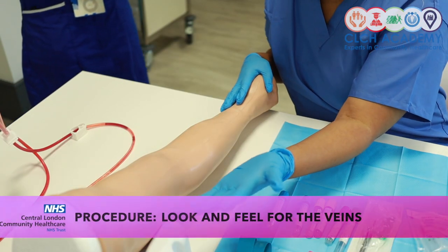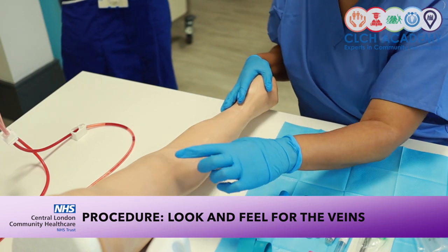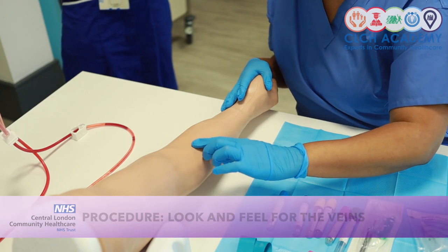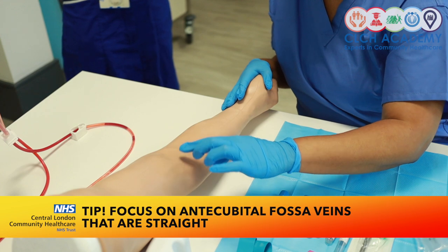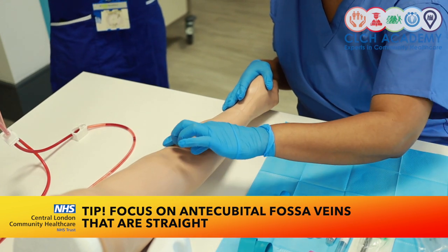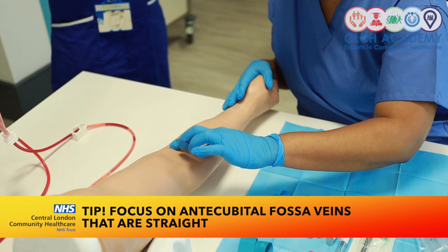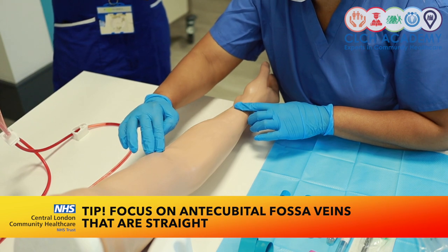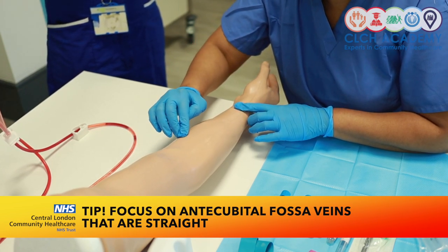Assessing the arm, I'm using a rubber arm, but the key aspect of assessing the patient is that with venipuncture, the focus tends to be the antecubital fossa. And you're looking at the different veins you're able to access within the antecubital fossa so that you can make a selection as to the vein that is most appropriate for you. Now, I like to have a good feel so that I get a good sense of where I'm going.